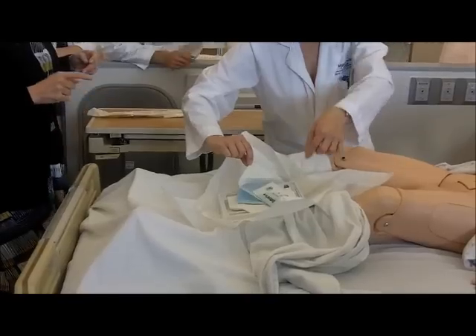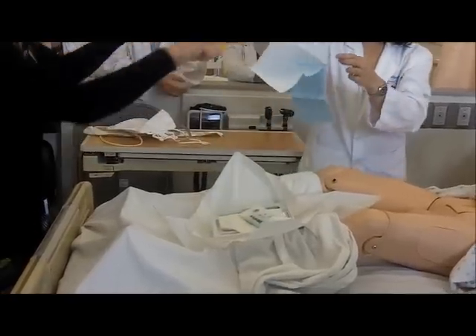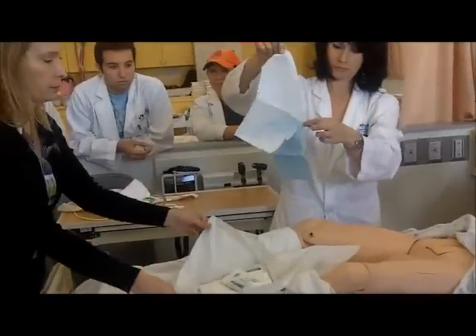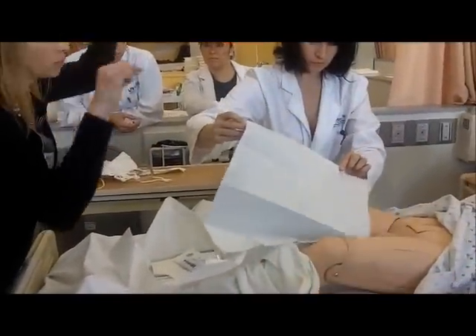You grab the ends. This is going to go underneath the patient's hips. So the areas that you can touch — it's always shiny side down.